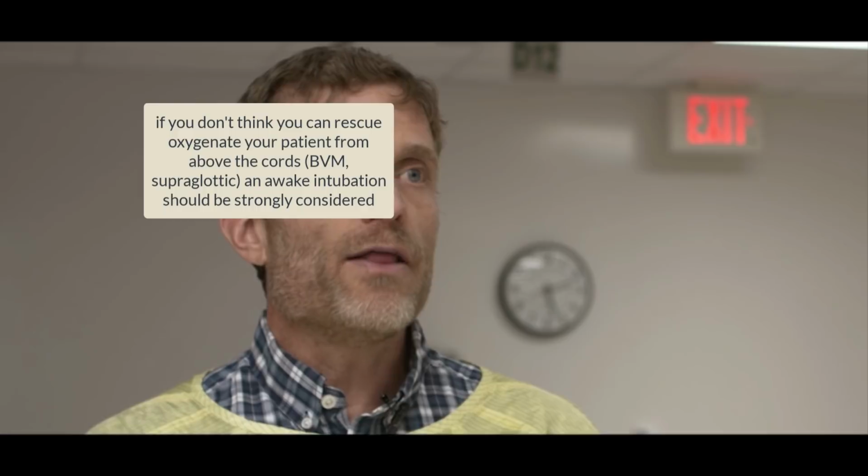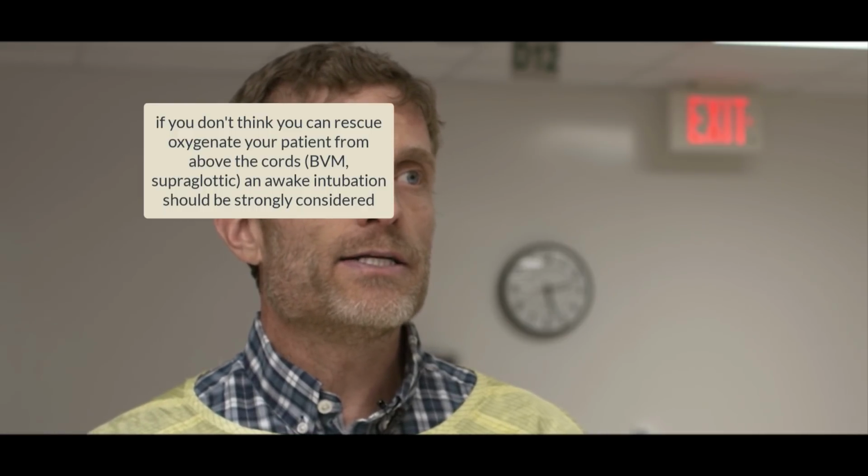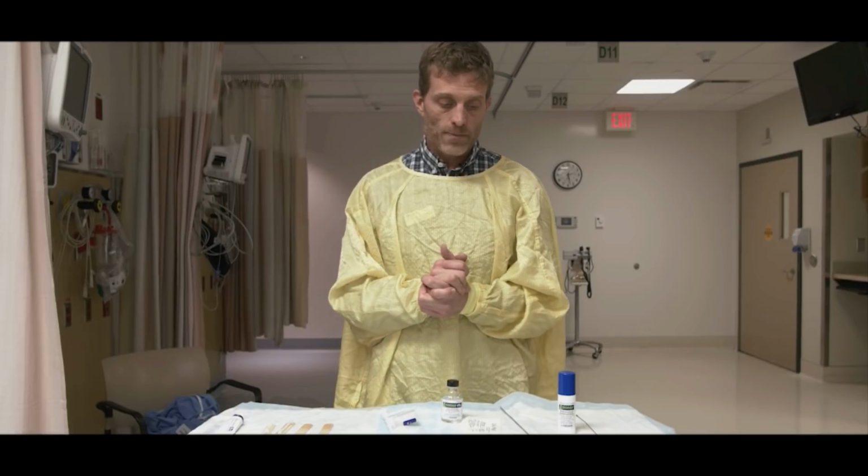There is some thought that, just on another point here, sedation. You saw we use no systemic medication here. And a true awake intubation is no systemic medication. It's pure topicalization. We want the patient to continue to breathe. We want them to follow commands. So we like to avoid sedation. There's a lot of what I call sedation facilitated awake intubation. And sometimes you'll just need to gather that little bit of extra cooperation.